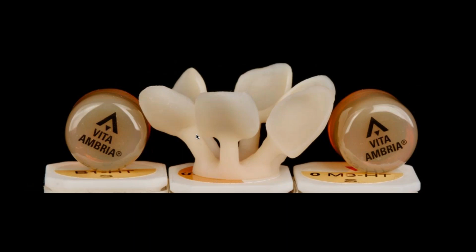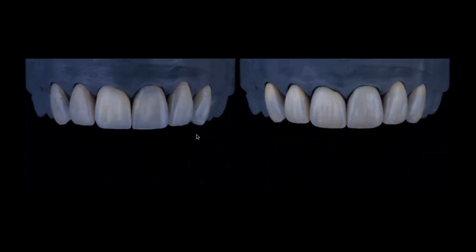These photos were taken by Telmo in Belo Horizonte, and for this case he did two sets of restorations for me, to explain the two different possibilities. What you have on the left side is what we call micro veneering. He presses and then adds a little bit of ceramic on the incisal third and the proximal facial aspects to get that additional touch of naturality.